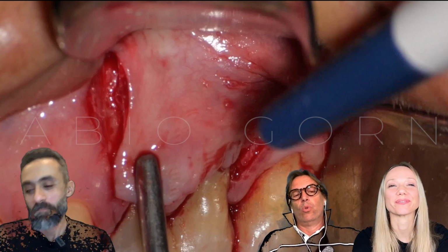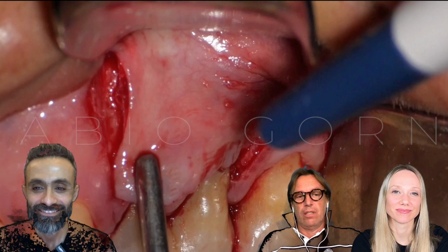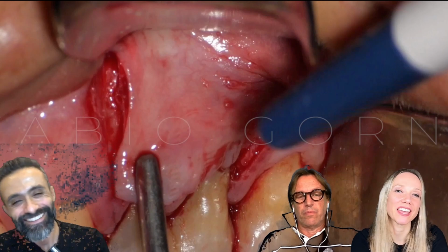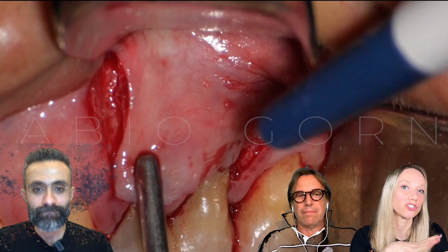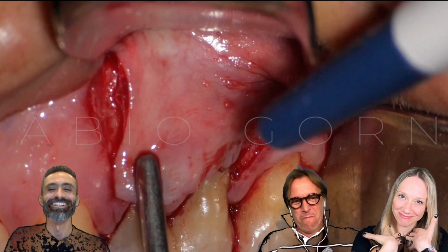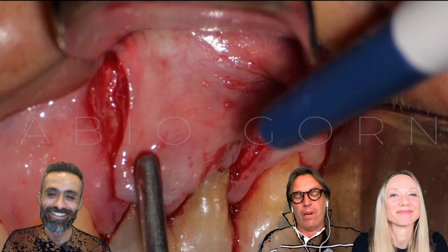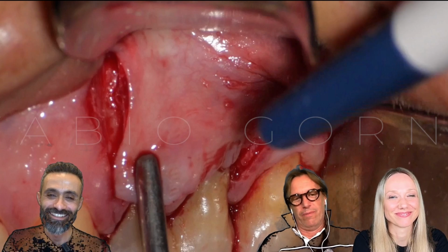But if you want to be more attractive for someone, if you want to be more fashionable, use another material. It's not my problem. I think the only problem with Super EBA is to mix it. Because your assistants, I know them and they are smart. In my case, I don't mix it. It's my nurse who mixes it, and I have three or four nurses, and all the nurses mix the Super EBA very well. So it's not a big problem.